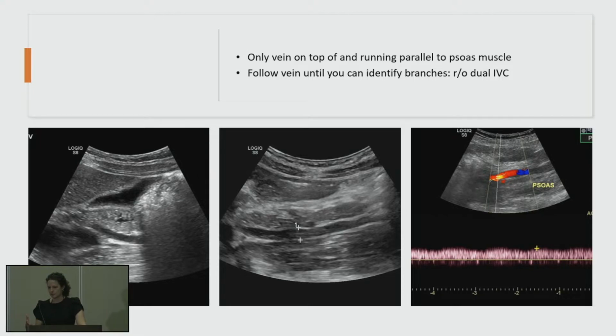So when you're trying to scan and identify that gonadal vein, I know this is one of the things, in talking to folks throughout the years, that it's so hard to see that gonadal vein. And I get it. It is hard. We're dealing with bowel gas and everything else, and it's one extra thing that you have to look for.